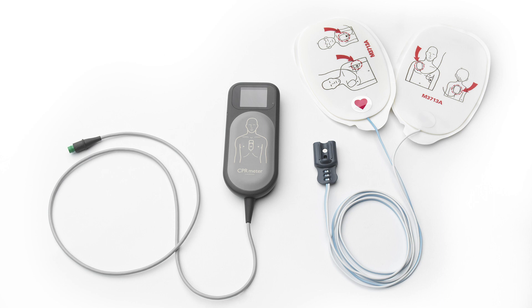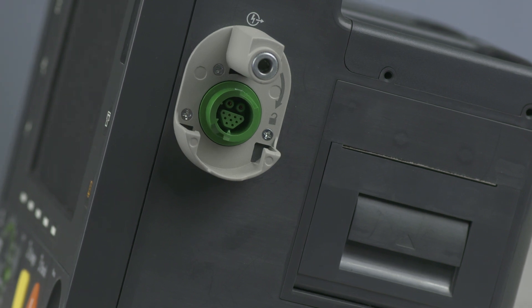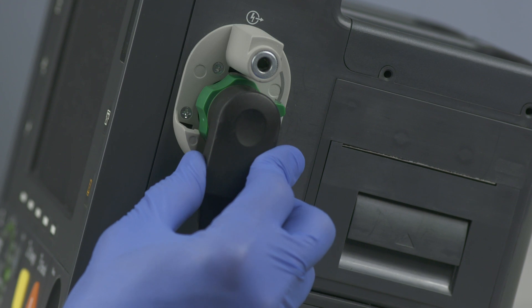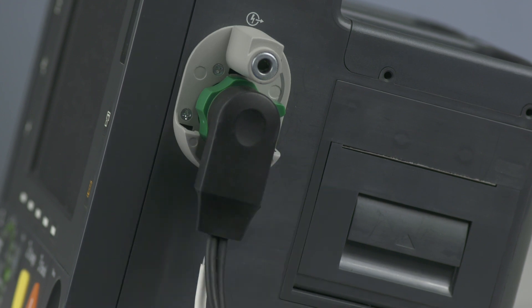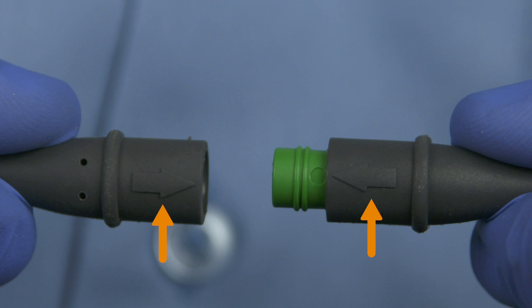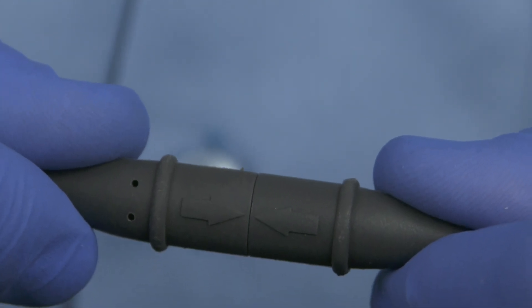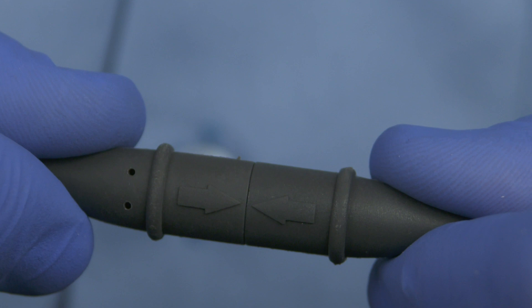Prior to using the HeartStart Intrepid, the Q-CPR meter should be connected to the device. To use Q-CPR, connect the PADS CPR cable into the green therapy port, pushing until you hear it click into place. To connect the CPR meter to the PADS CPR cable, align the arrow on the CPR meter cable with the arrow on the receptacle end of the PADS CPR cable. Push until you feel it snap into place. There should be no gap between the two connectors.